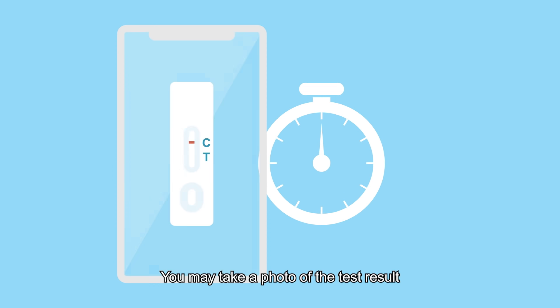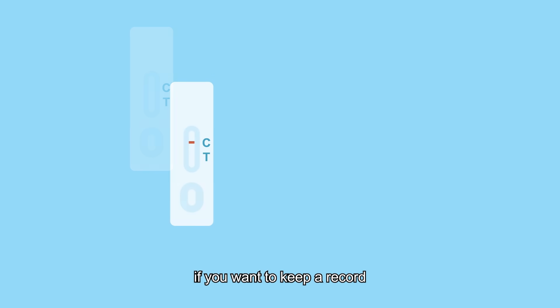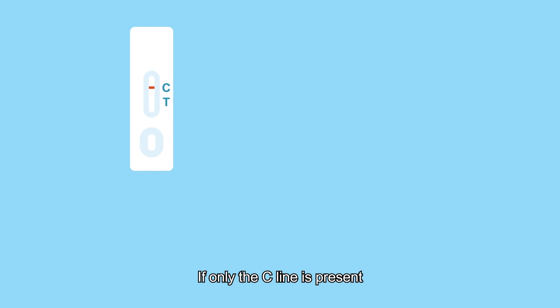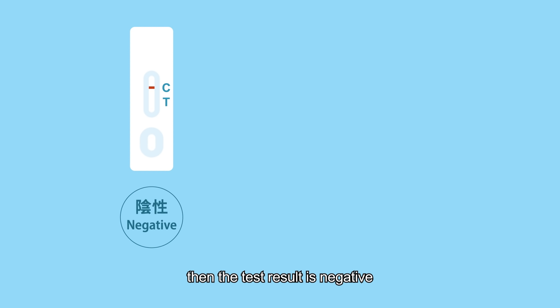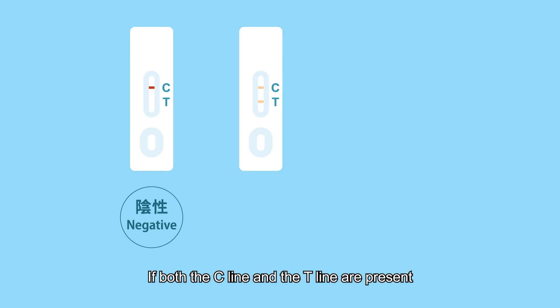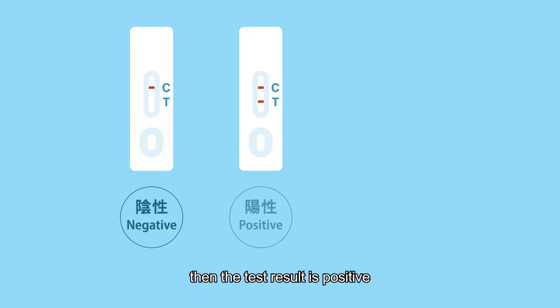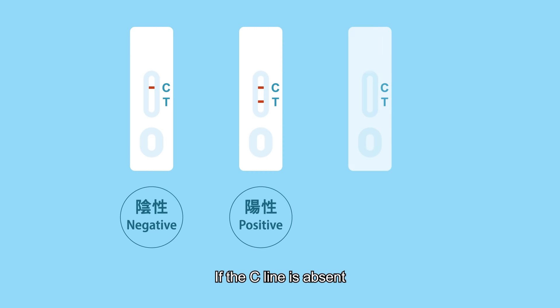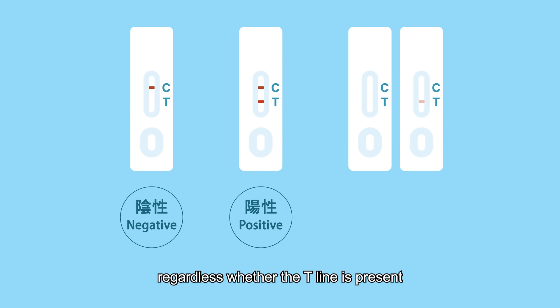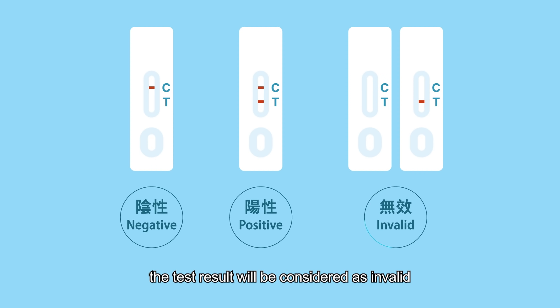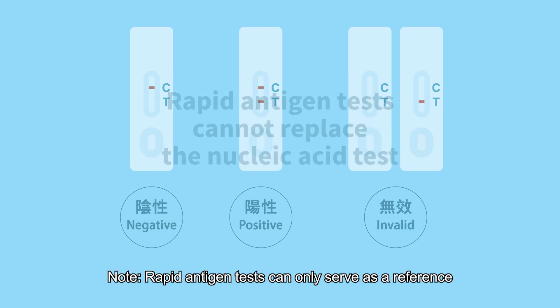You may take a photo of the test result if you want to keep a record. If only the C-line is present, then the test result is negative. If both the C-line and the T-line are present, then the test result is positive. If the C-line is absent, regardless whether the T-line is present, the test result will be considered as invalid and you should do another test with a new test kit.